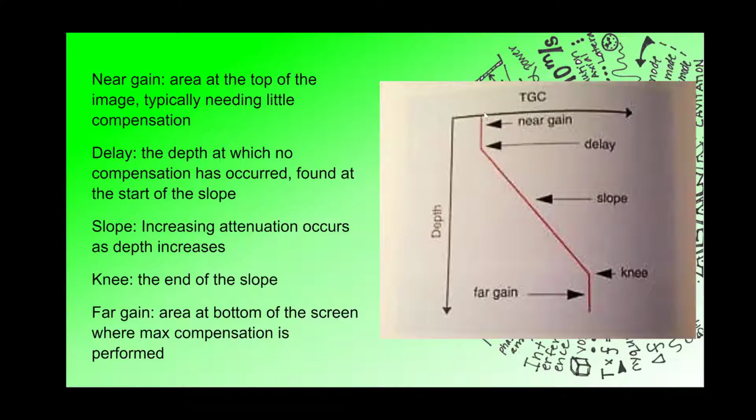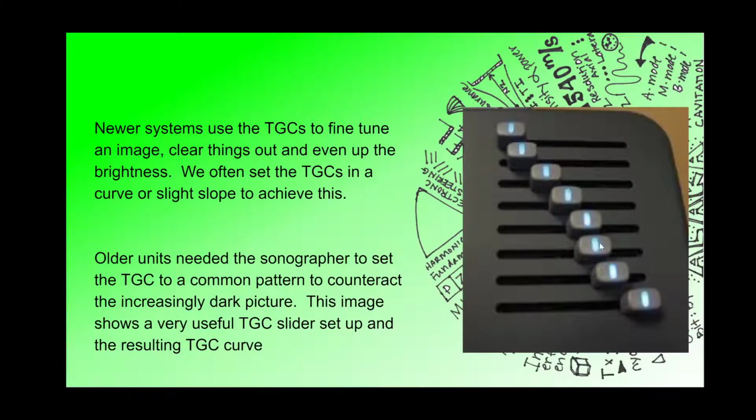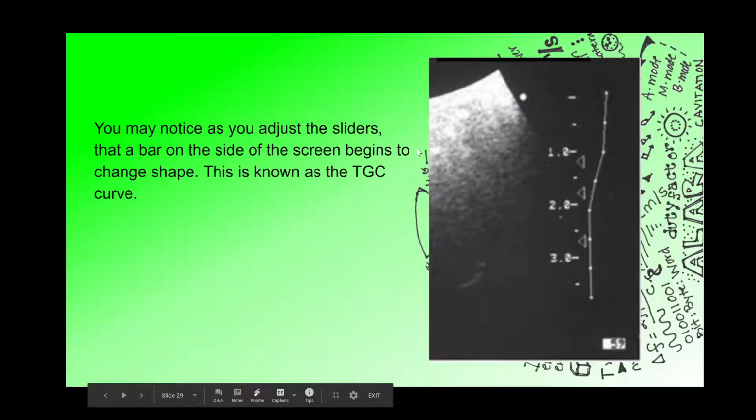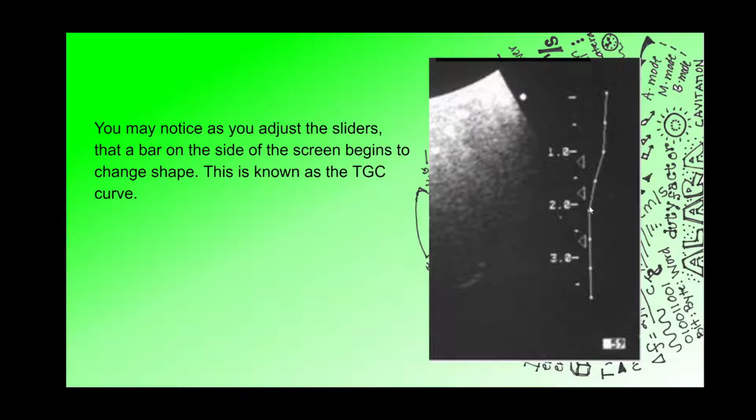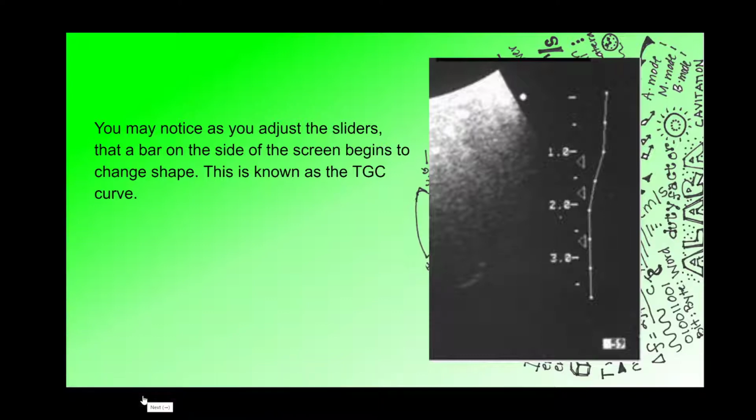So remember again, the knobs on the top adjust the near gain. When we start to create our slope is where we have the delay. We then have the slope, which is the angling of the knobs as they move down towards the knee. And then the knee is the beginning of the maximum gain in the far field. So I just want to go back to another picture here. Again, we have the near gain, the delay, the slope, the knee, and the far gain. And again, all of our slopes are going to look different. Again, near gain, delay, slope, knee, far gain. So you can kind of see how there's similarities to the slopes. None of these are jutting out in any one direction. That's not part of our TGC curve.